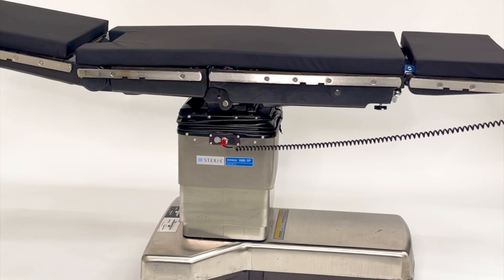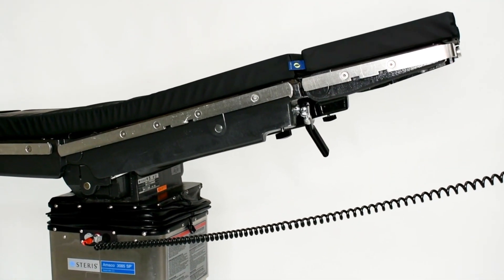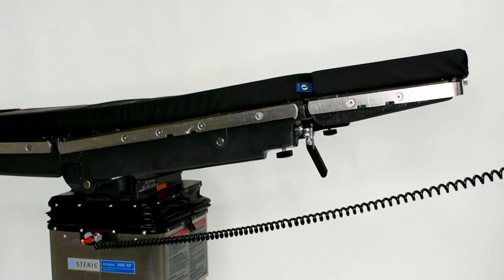All surgery tables purchased from KenMed come with biomedically certified paperwork, new pads and batteries ready for use.